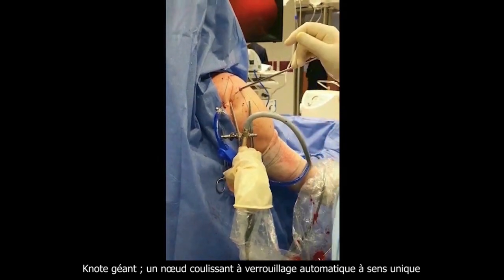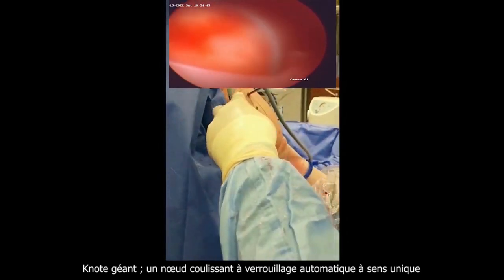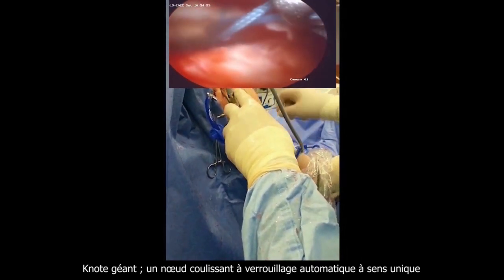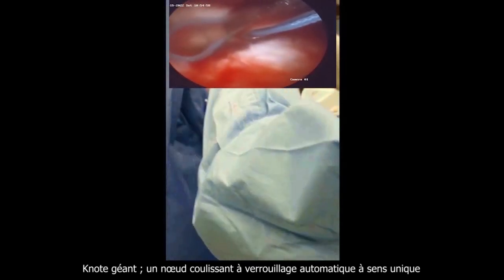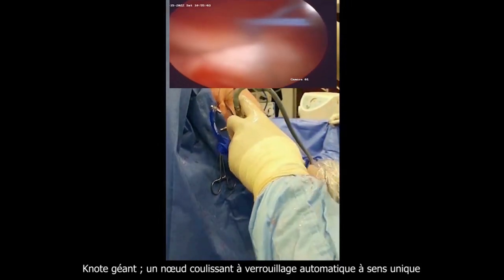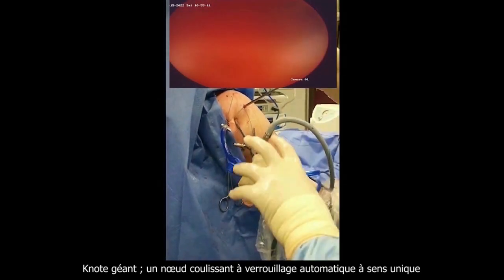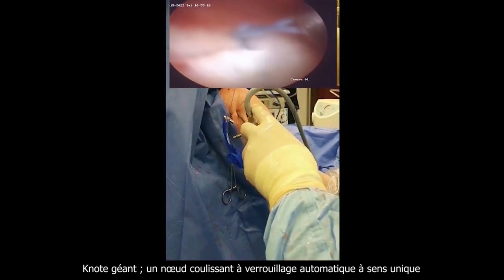the knot will be pushed inside the subacromial space, and that under tension of the post. And we see here, this is by pushing the knot inside, the 2 ends of the tendon come together and the tendon is fixed to the bone.